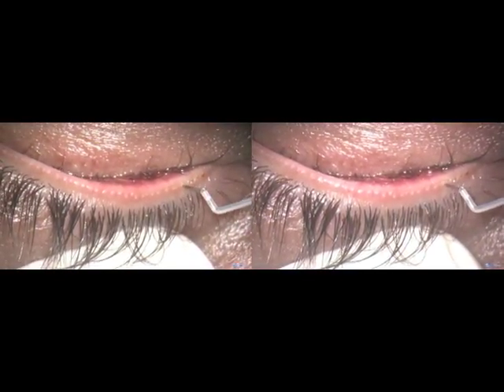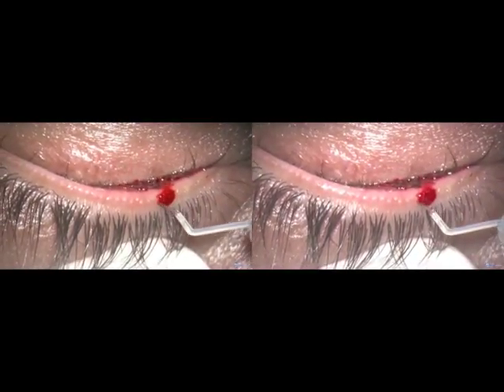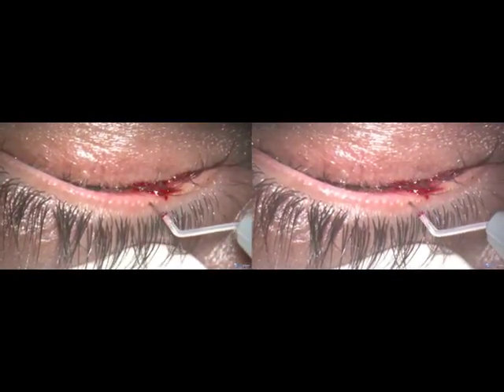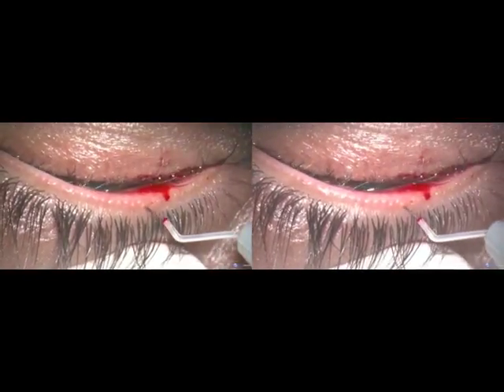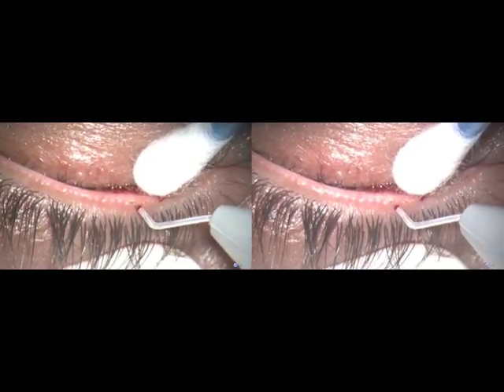Surgery is very easy. Lignocaine is injected into the lid all along the lid so there is no pain during the procedure. Sometimes you get a droplet of blood. A 2 mm long Fugoblade tip at medium energy is used — it's not a needle — it removes the things that block the meibomian glands.